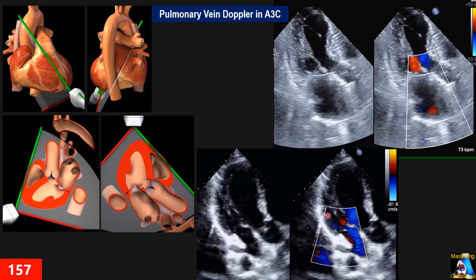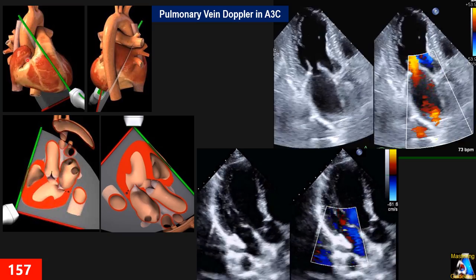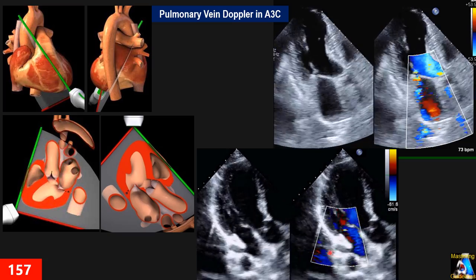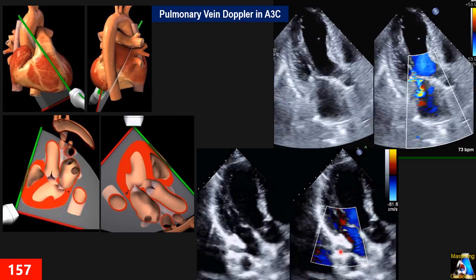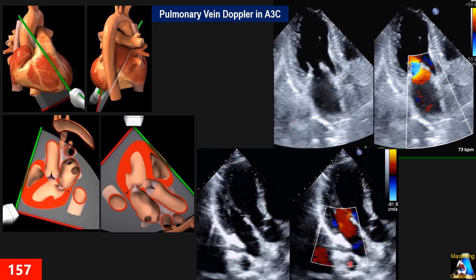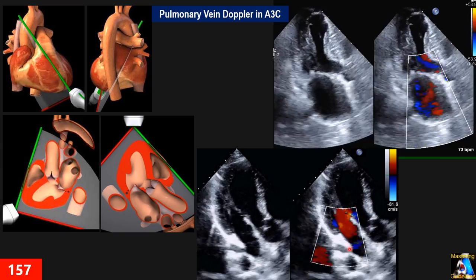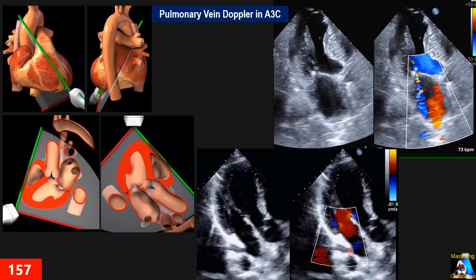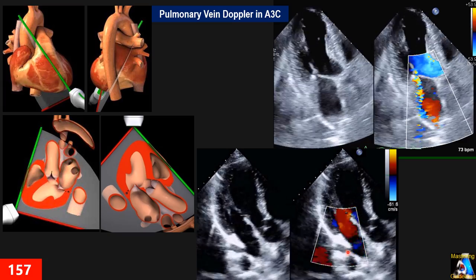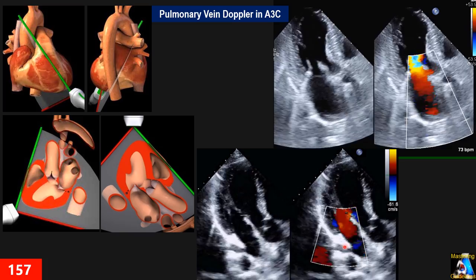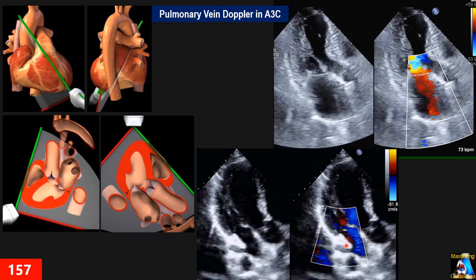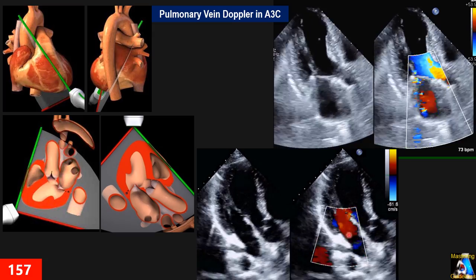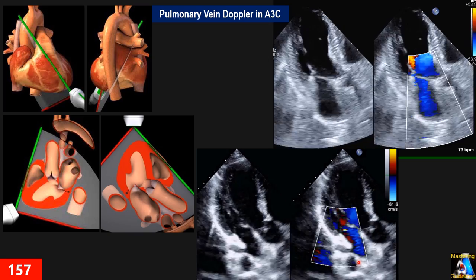In the apical three-chamber view, if you fan or slide to the left of the patient, or twist a little more clockwise going slightly off-axis, you can actually see the left pulmonary vein — anterior to the thoracic descending aorta — which is usually the common entrance of both superior and inferior left pulmonary veins. However, the problem with apical three in this view is that we cannot do pulse Doppler because the sound beam is almost perpendicular. So for the left pulmonary vein, we go to the parasternal or PSAX windows.